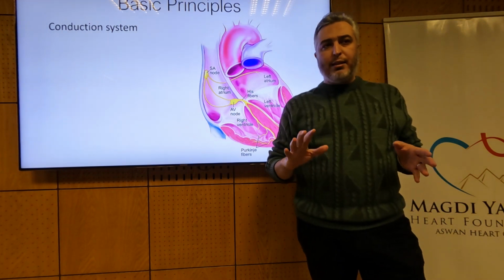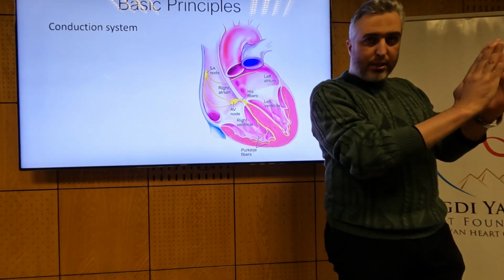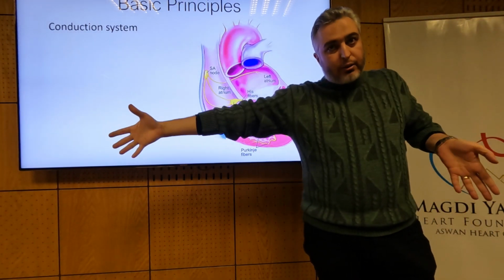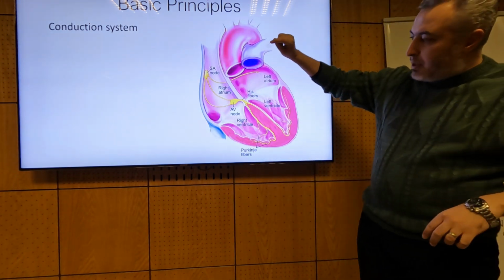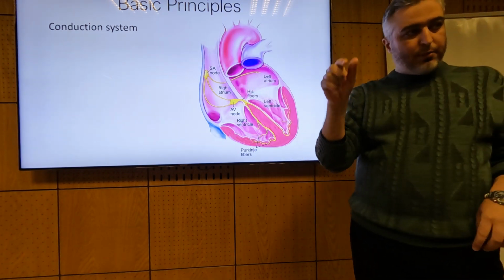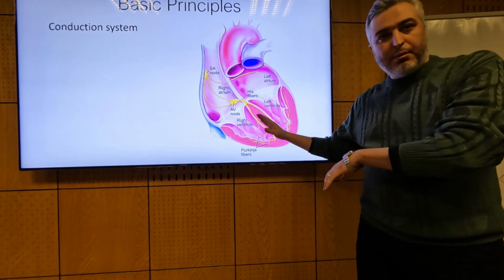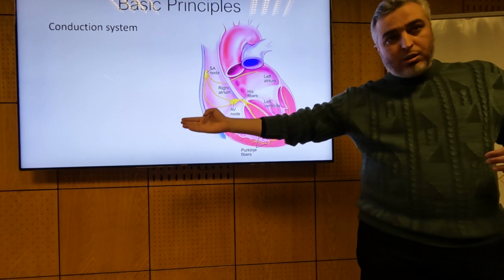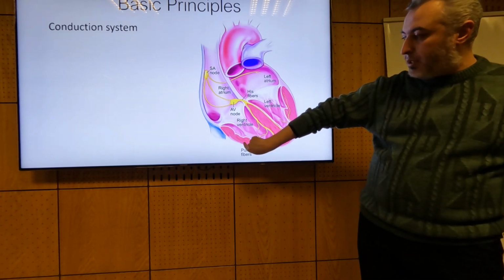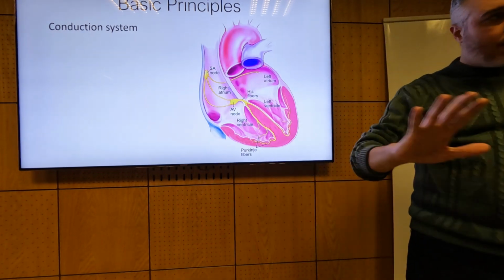How on ECG would you say that the excitation wave took long or took a short period? The width of the QRS. So if the QRS is narrow, this means that the excitation wave was very quick. If it is wide, then it took longer time to happen. So if the QRS complex is caused by an excitation wave coming from the AV node through bundle of His, the QRS should be narrow. While if you stimulate the free wall of the ventricle and then eventually this reaches the septum, then the free wall of the left ventricle, it will take longer, and so the QRS will be wider. Okay? And exciting the free wall of the right ventricle cannot cause stimulation of the bundle of His and then continue as fast. It will continue as the slow conductivity across the cells.